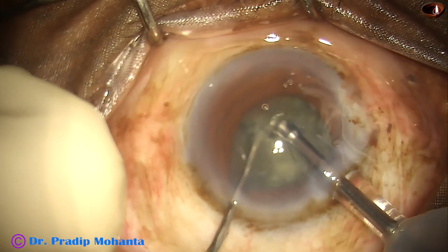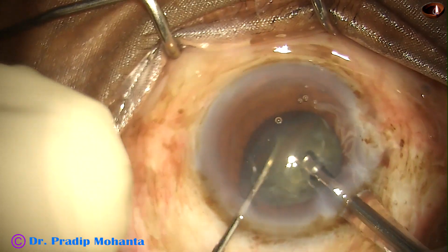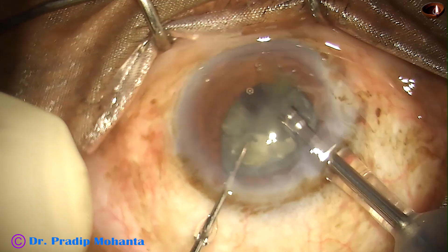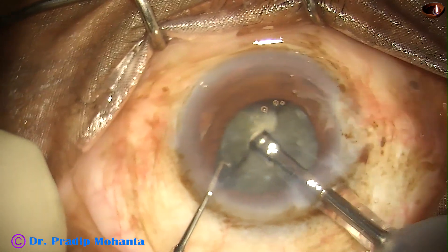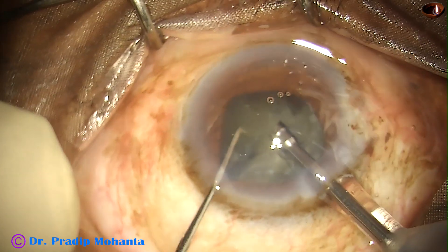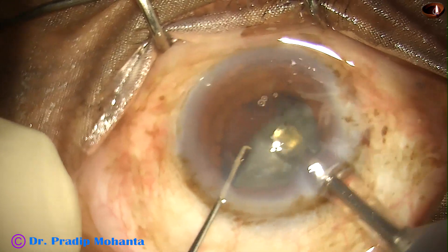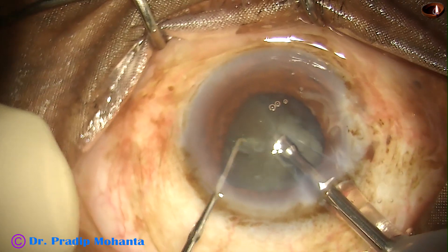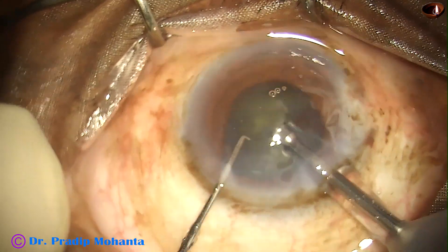Beautiful hold and very nice purchase on the nuclear pieces. As soon as the tip is occluded, the mode converts to pulse mode — it is called O-pulse mode or occlusion pulse mode. The tip remains in continuous mode, but as soon as the tip is occluded, it goes into pulse mode. Chopping is done in continuous mode and emulsification is being done in O-pulse mode.